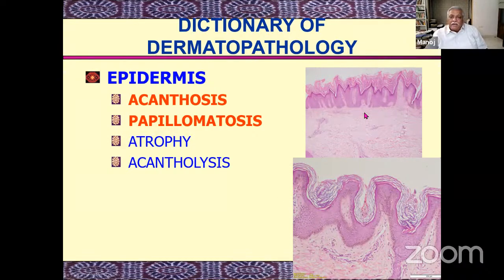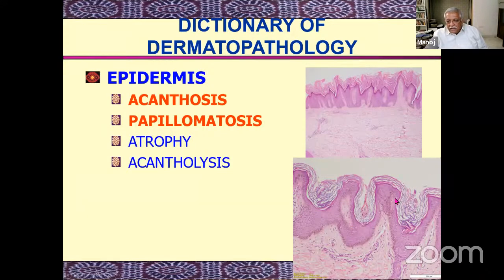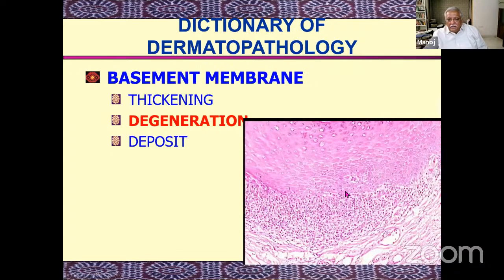Once again, we come back to our good friend papillomatosis, the church steeple. Could be pointed like this, could be blunted like this. But the important thing is that there is proliferation going on of the epidermis, and the proliferation of the epidermis is causing an elongation of the epidermis. Make out that the epidermis is going like this. Instead of becoming a thick cushion like this, it is going like this. This is more like a cushion. The earlier one which you saw was the church steeple.